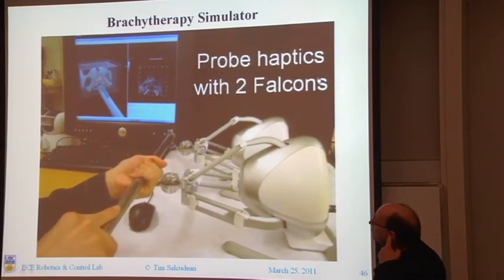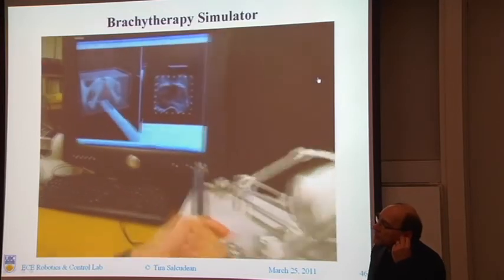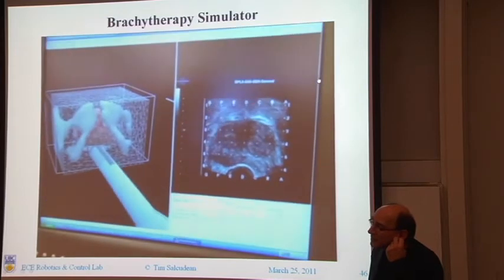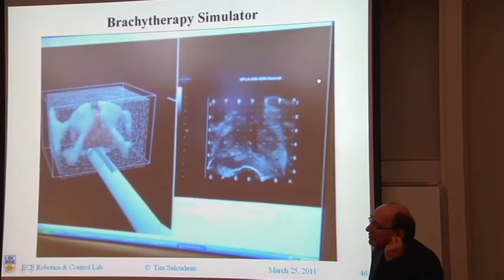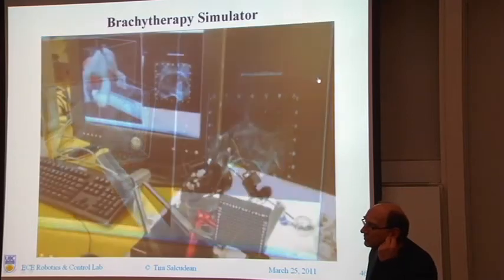The interior diameter of the needle is 0.6 millimeters. So it's tiny. Yeah, and it's about half a centimeter long.